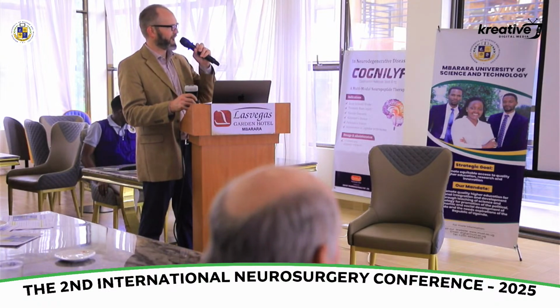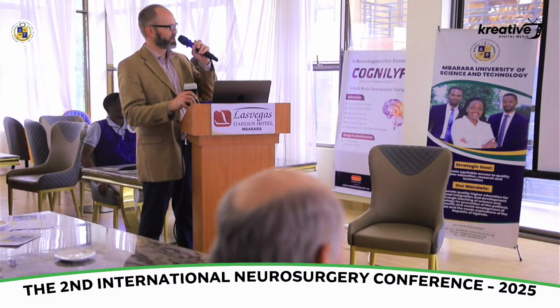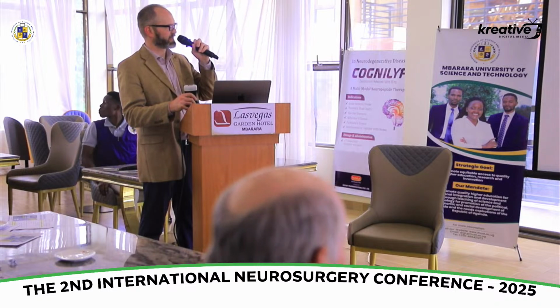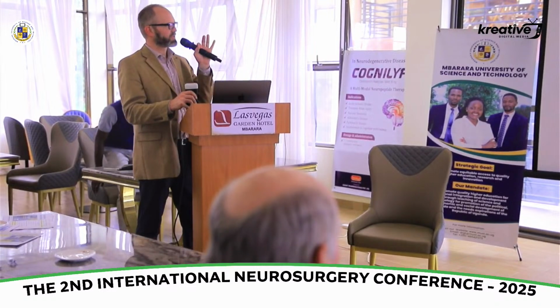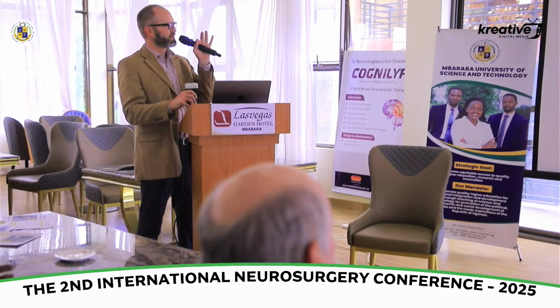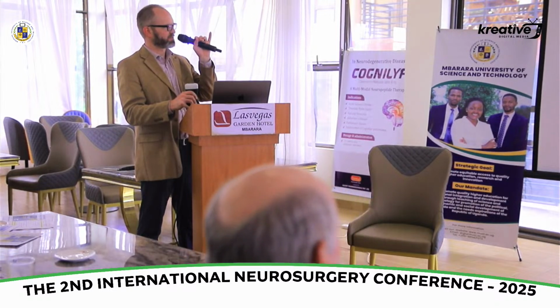We come back, and now we see the third ventricle, and then we swing back and you get into the brainstem. So it's not quite as good as a real baby would be in terms of imaging, but you can see in this patient you have hydrocephalus. You can see the bone, the middle fossa floor depicted here.